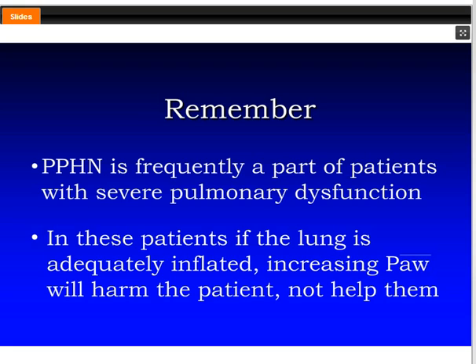And so we recognized that if you used a little bit less inspiratory time, or duration of duty cycle on inspiration, you could more effectively avoid air trapping in those patients. But there are times when you need to deliver a little bigger tidal volume, and that's accomplished by increasing the inspiratory time.